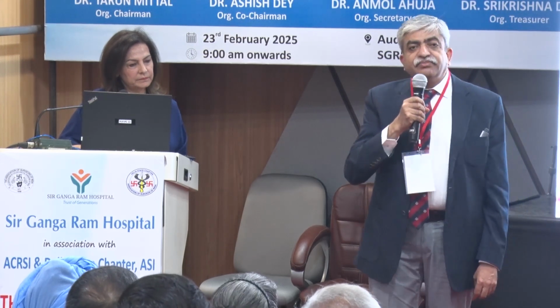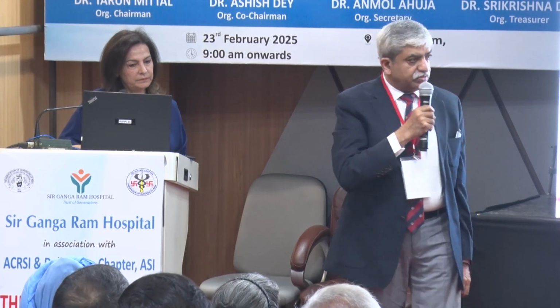Otherwise, for a very simple straight fistula, where you can feel the induration under the skin, and it's very close to the anal canal, probably you do not need MRI.